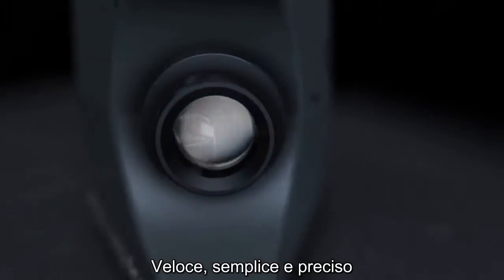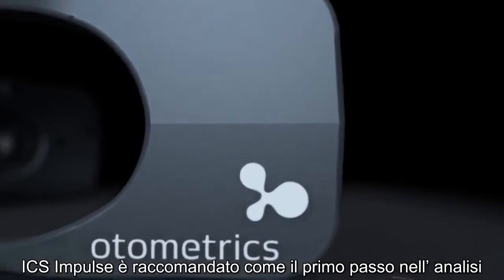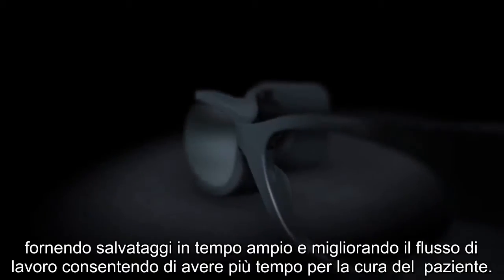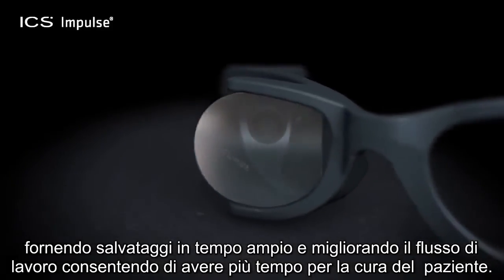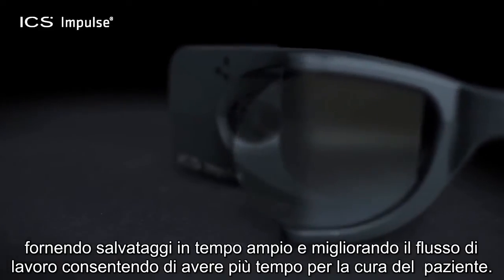Fast, simple, and precise. ICS Impulse is recommended as the first step in analysis, providing vast time savings and improving your workflow, allowing for more time spent on patient care.